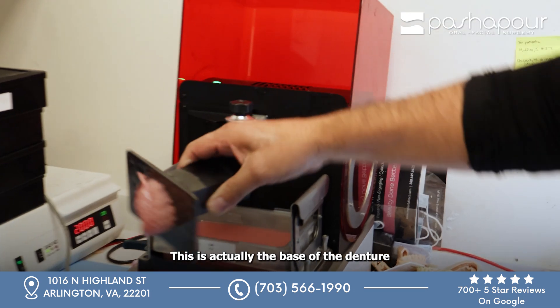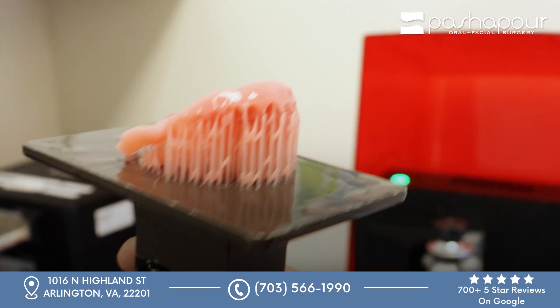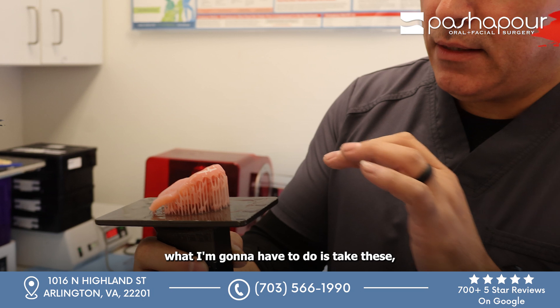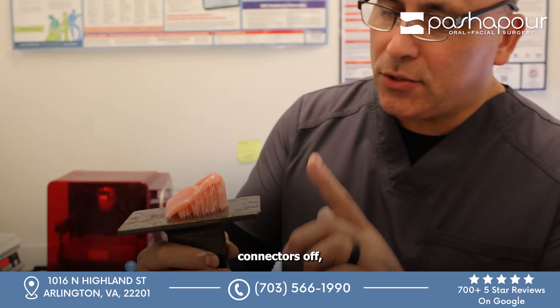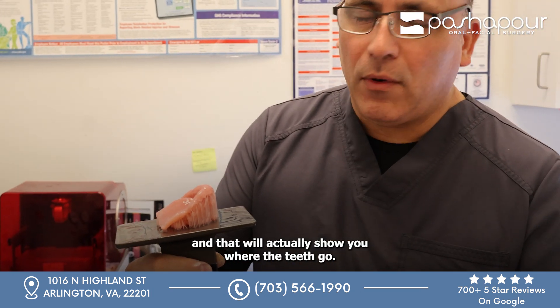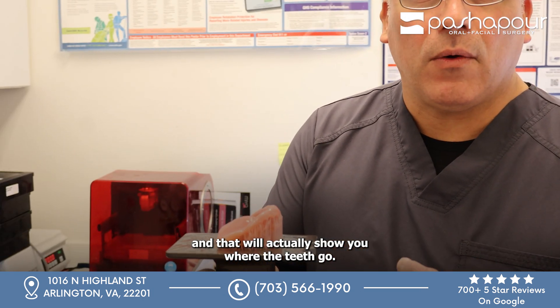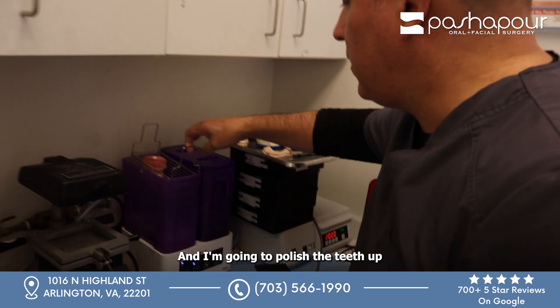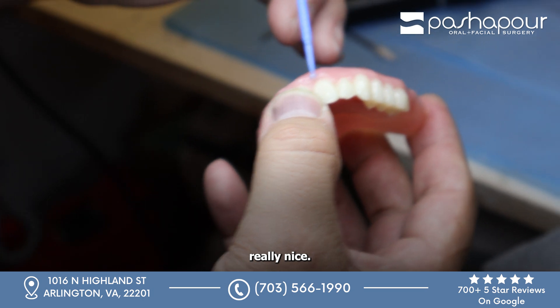This is actually the base of the denture — digitized and 3D printed. I'm going to show you where the teeth go. I'm about to mill it, sealing it, and that's done.